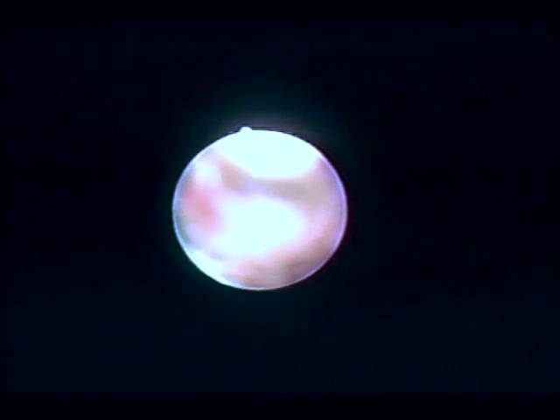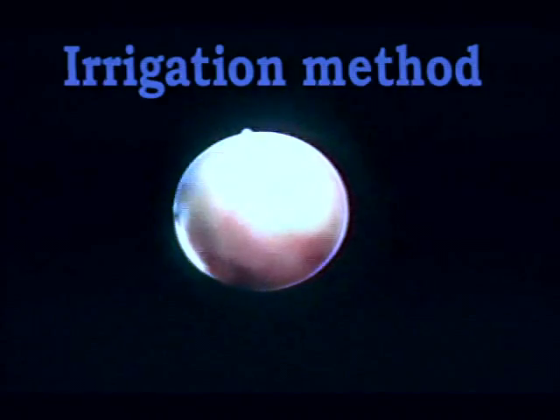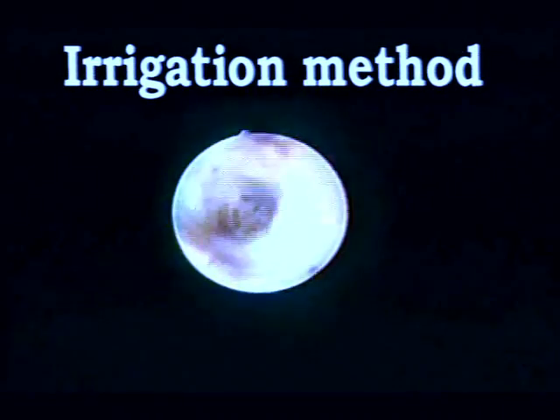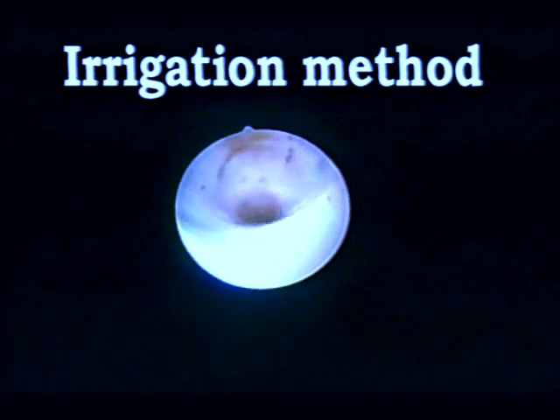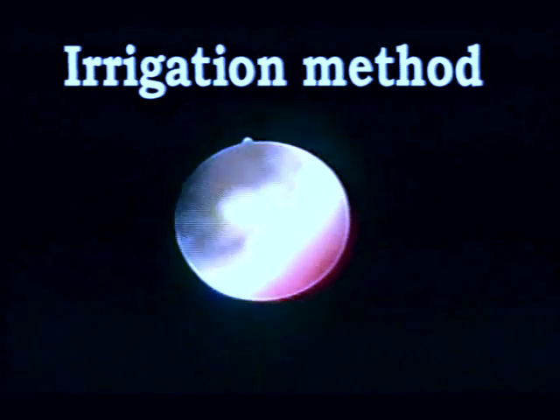When a large stone is fragmented into small pieces, while small stones are located in the peripheral duct, normal saline irrigation can be a very effective way to remove all the stones with sludge material. If we try to remove all the pieces by repeated basket use, it would be a labor-intensive and time-consuming procedure.